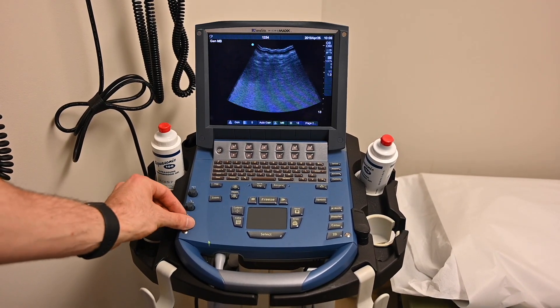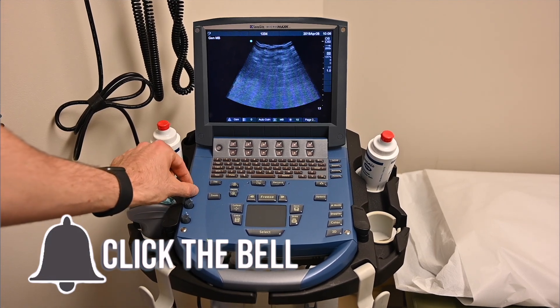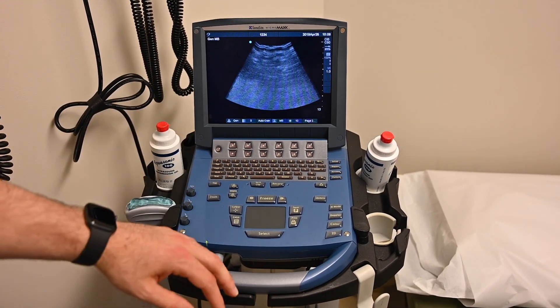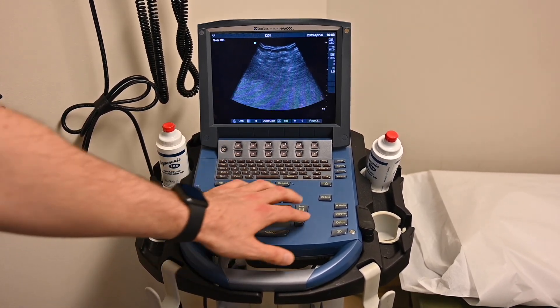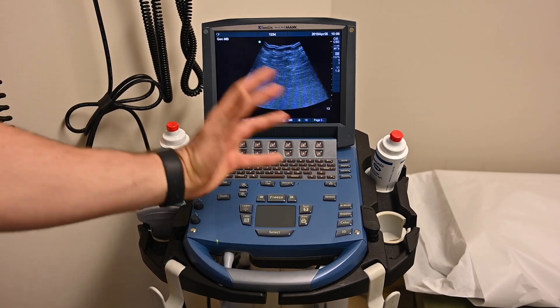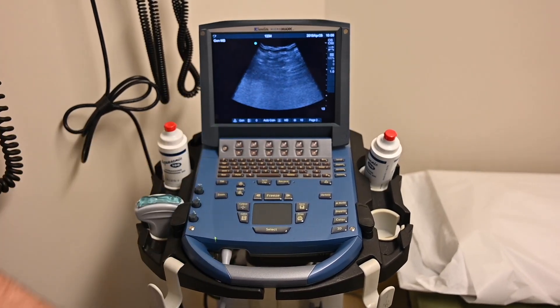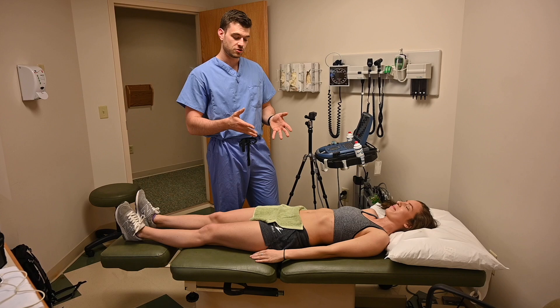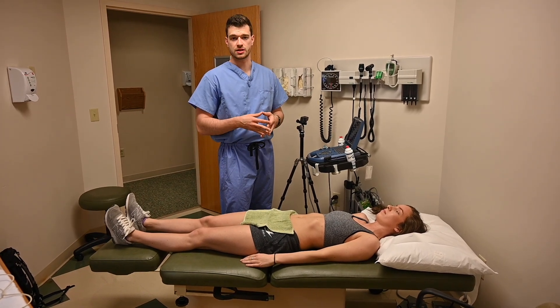There are a lot of functions on this machine. Most often you'll use the total gain knob, a far field gain, and a near field gain — these change the brightness of the image. Many machines today are touchscreen and don't quite look like this. Depth is another important control, changing how deep you're scanning. There are also different modes: color would be for looking at arteries and flow, and M-mode is motion detection. We're going to focus on the basics and the E-FAST, which is what you'll most likely do on an ER rotation. We have Stephanie here as our scanning model.